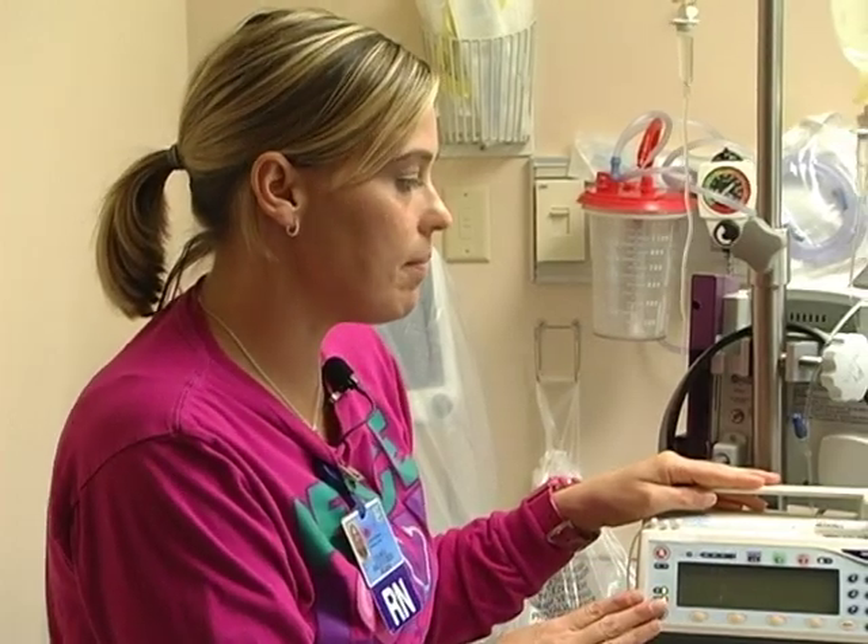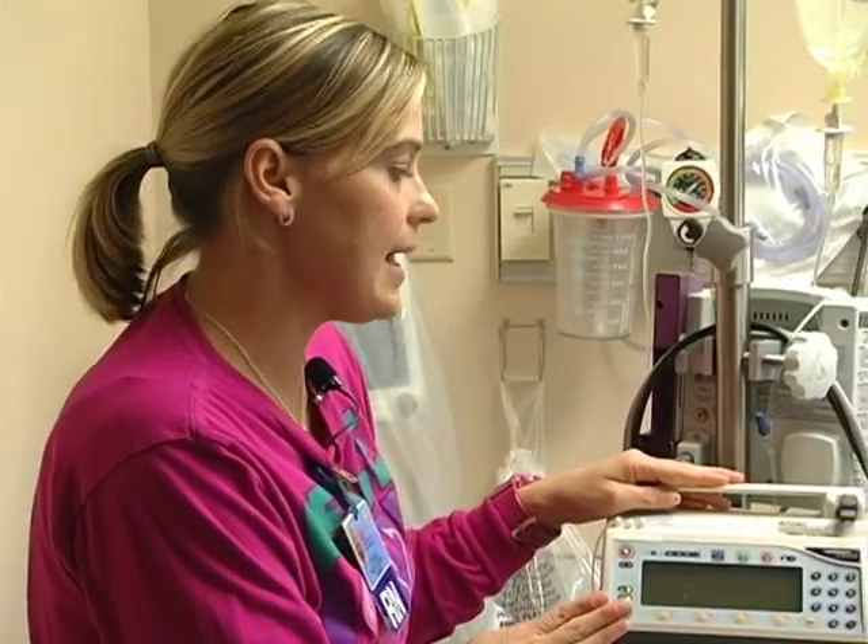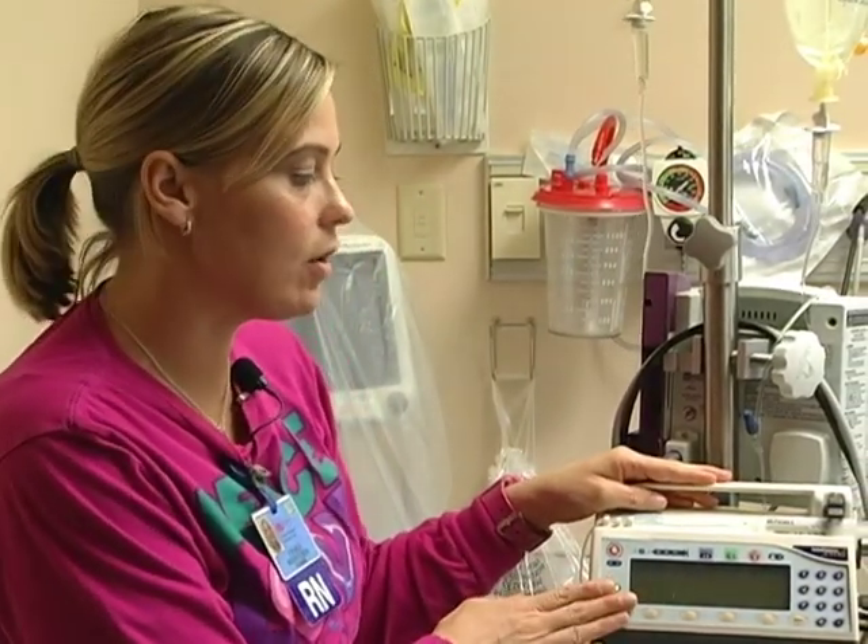We are going to store the Medfusion syringe pumps in our med room on the counter and just make sure that it is plugged in at all times.